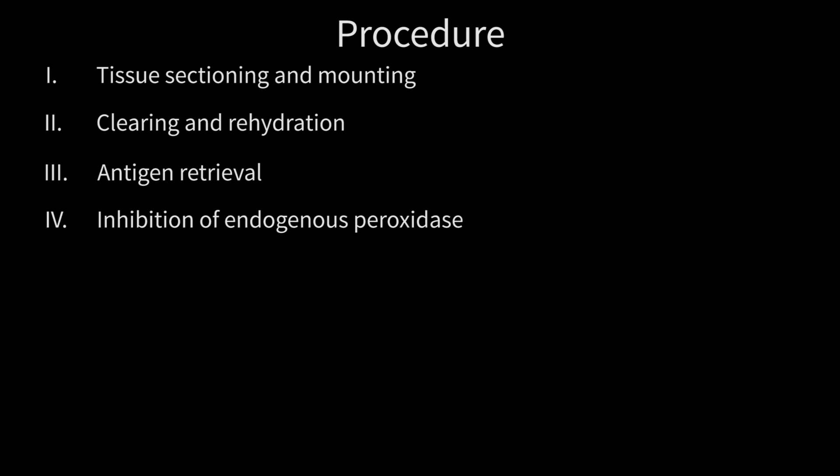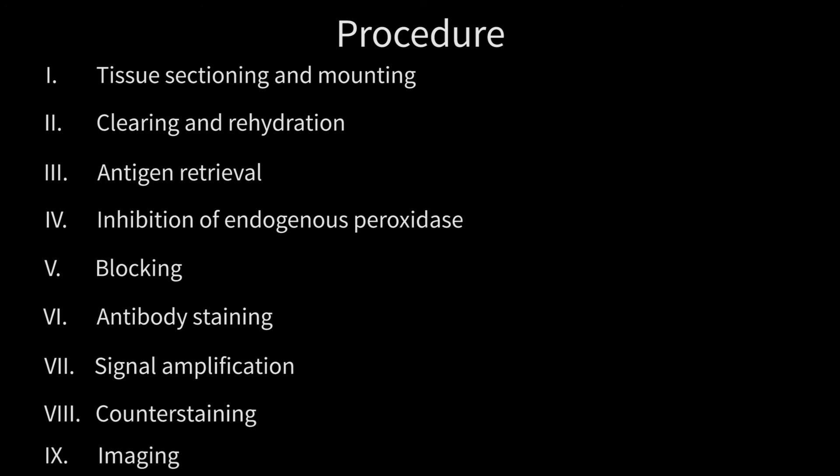To summarize, this immunohistochemistry video has demonstrated the following techniques: tissue sectioning and mounting, clearing and rehydration of the slides, antigen retrieval, inhibition of the endogenous peroxidase, blocking, antibody staining, signal amplification, counter staining, and imaging of the slides.